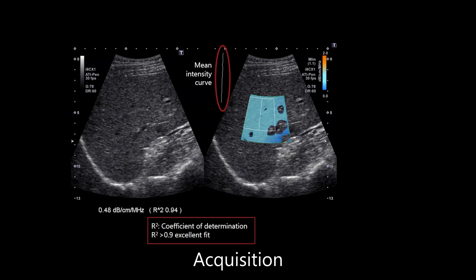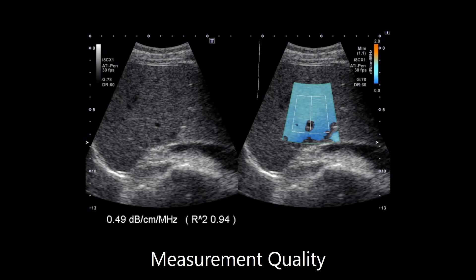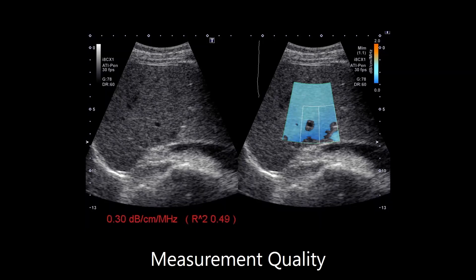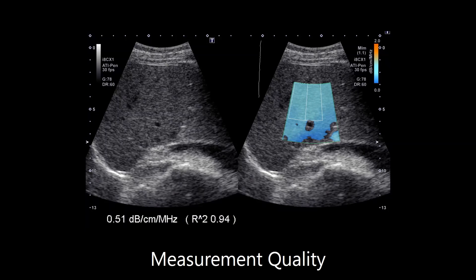An R-squared value of greater than 0.9, as seen here, indicates an excellent fit to the expected model. Measurement ROI placement can be guided to regions of high quality by observing the font color of the attenuation coefficient. A red font color indicates an area where measurements should be avoided. A yellow font color indicates an area where measurements may be unreliable. Reliable measurements can be made when the attenuation coefficient is displayed in white, indicating an R-squared value of greater than 0.9.